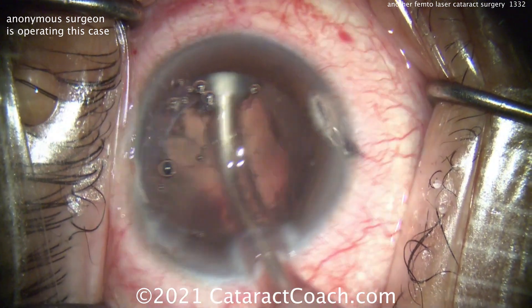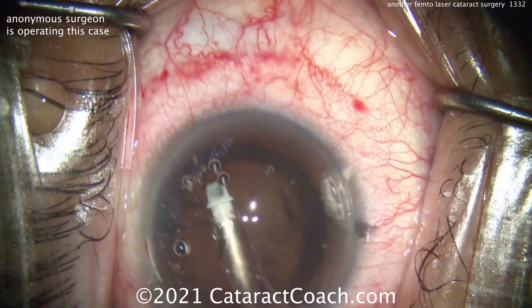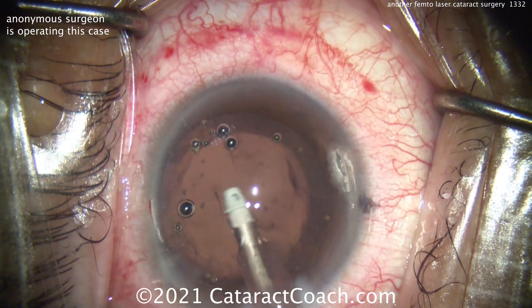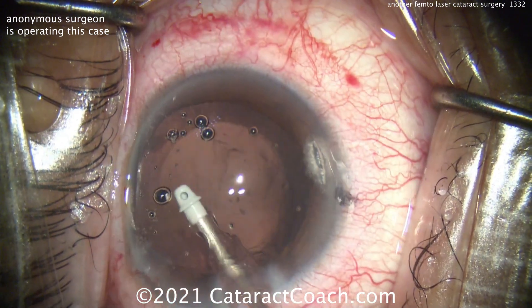So you can see the technique is very nice here — it's a circumferential removal of the cortex. That looks really good, and then just getting some of those wispy strands out.